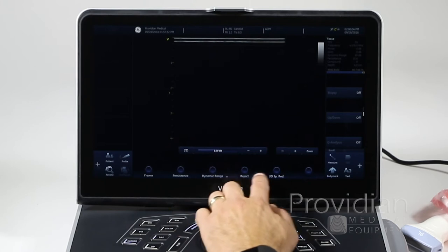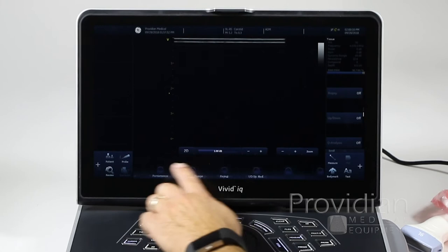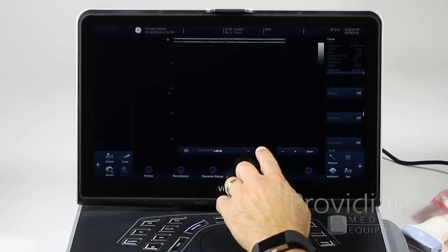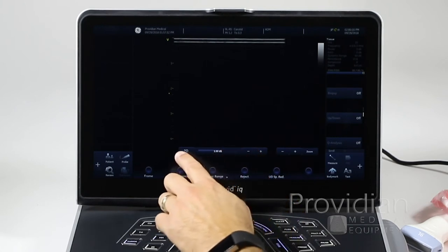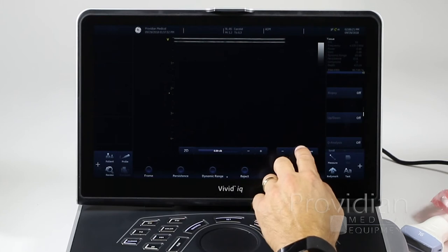The same scrolling applies along the bottom. There are two dots, so you can scroll back and forth across those controls as well.